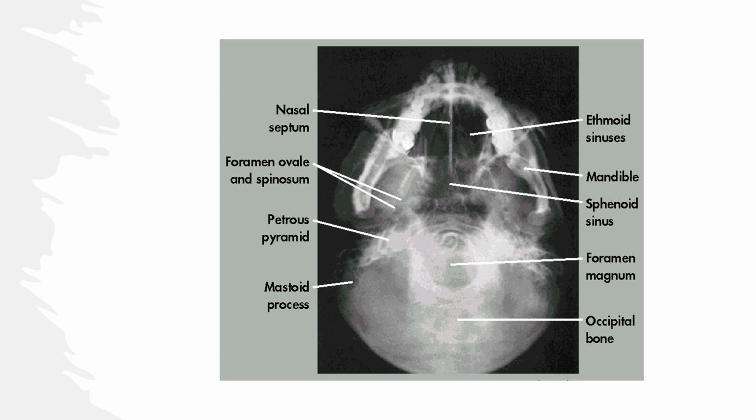That's exactly where you want to direct the crosshair. Okay. Now, the infraorbital line has to be, how far do they tip their head back? Extreme extension is how I would call this.